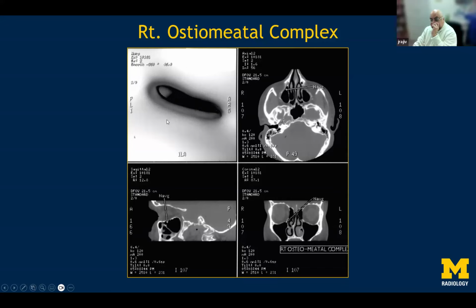Tool to see the sinus opening. This was done way back in the 80s and 90s when we were at PGI. We were at PGI and we published a paper on looking at the sphenoid ostium and how the sphenoid ostium looks on virtual sinuscopy, and it was pretty well received at that time. So it's one of the pioneering works done in India on 3D imaging.